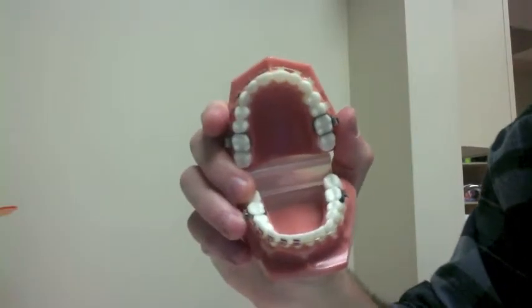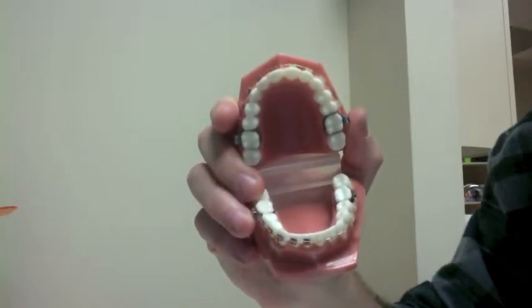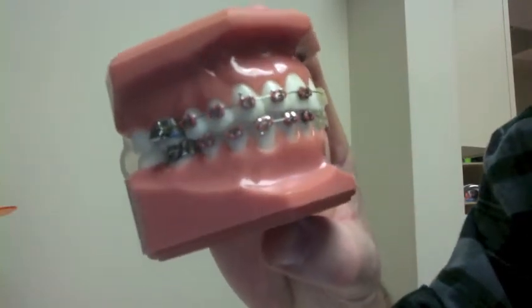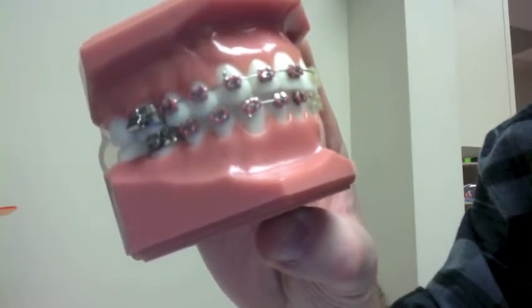So the braces I use are different than a lot of my colleagues, and it's an important difference, so I want to take a minute to tell you about that. The braces that probably 85% of all my colleagues use look like the brackets and braces that you see in the models here. If you look closely, you'll notice that there's little rubber ties that tie the wire into the bracket slots, and you'll see here there's some pink ties in every bracket.